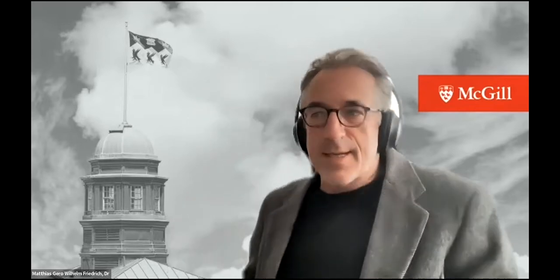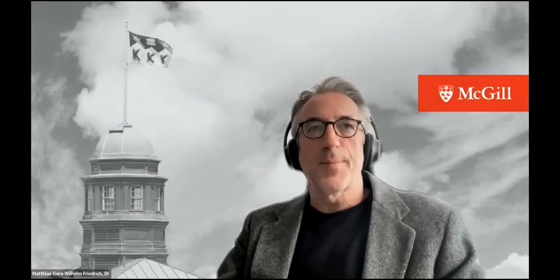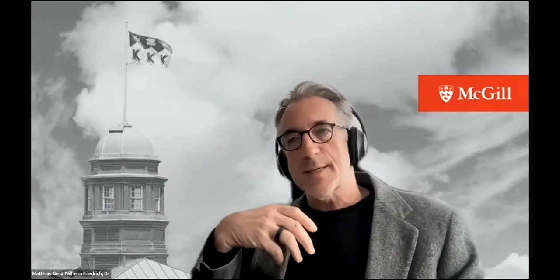Okay. I have one final question before I hand over to Bettina to announce the next one. What I'm very interested in is if you have a special stress on a certain tissue, such as with mitral valve prolapse on the papillary muscle, and as you have seen, the wall thickness or the hypertrophy of the inferolateral wall may give some clues here. What I always suspect is that this stress leads to some reversible repetitive injury.